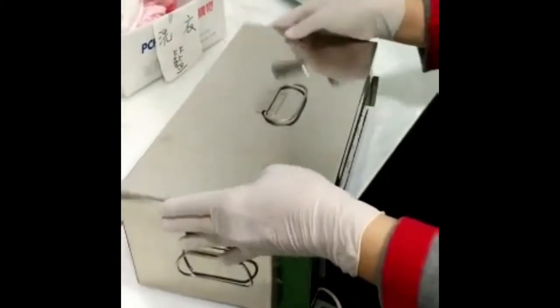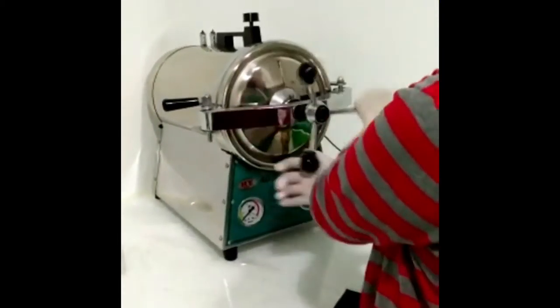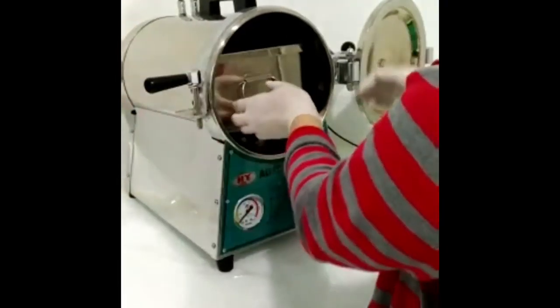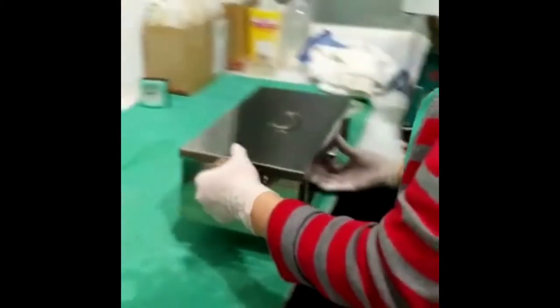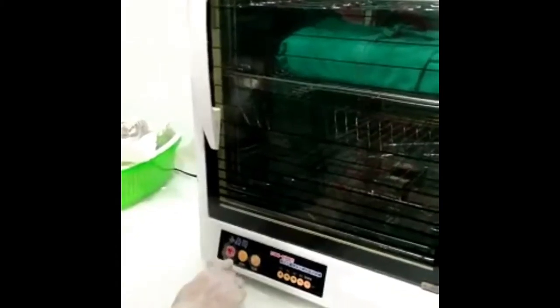An indicator is attached to the surface of the package so that after sterilization is done, we can check the result. We put the package into the rigid container, then into the autoclave. After the sterilization process is done, all materials will be taken out from the rigid container.